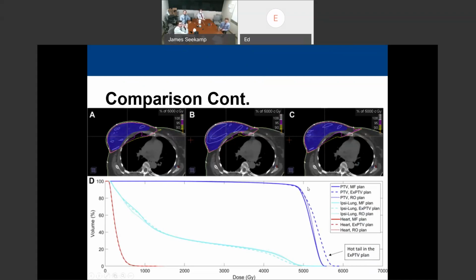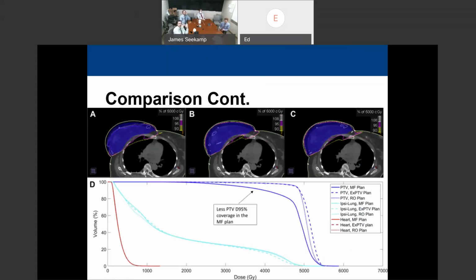And then what they did is they perturbed the dose and said that the patient had shifted this much during treatment, and then they reevaluated. You can see the plan where they manually added flash actually did an exceptionally poor job of meeting any kind of prescription coverage or giving adequate coverage at all after the patient had swollen or was set up slightly incorrectly. Whereas the robust optimization and the virtual bolus technique are both fairly satisfactory.